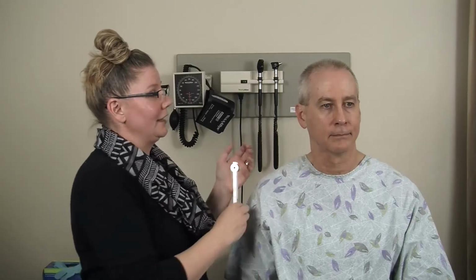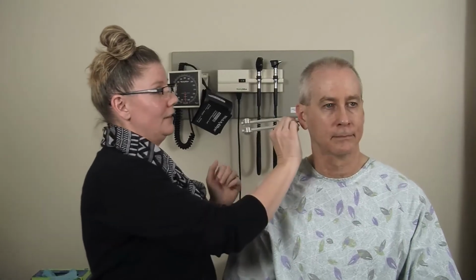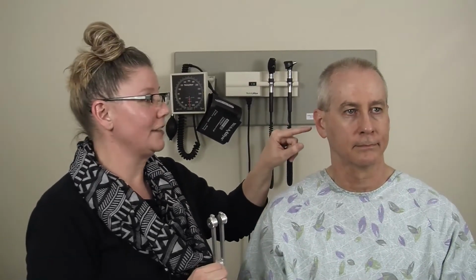Now, if we did the Rinne test, and Steve said he can no longer hear it, and I move it in front of his ear and he doesn't hear anything, what that tells me is that he has a conductive hearing loss in this ear. So bone conduction is greater than air conduction. That would be a conductive hearing loss in his right ear.